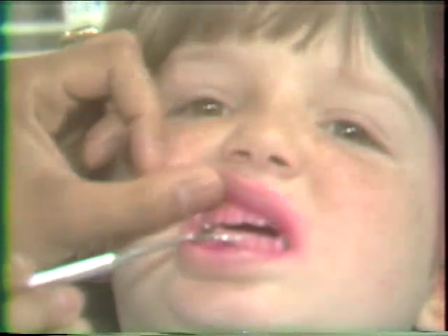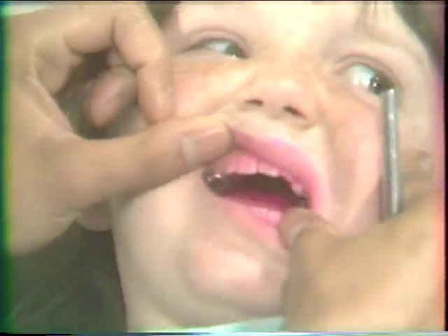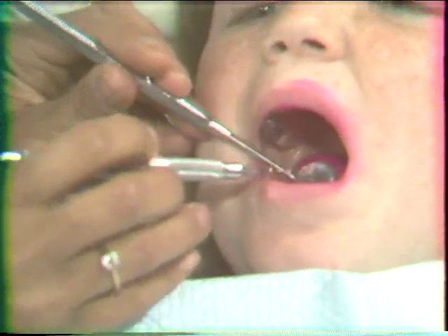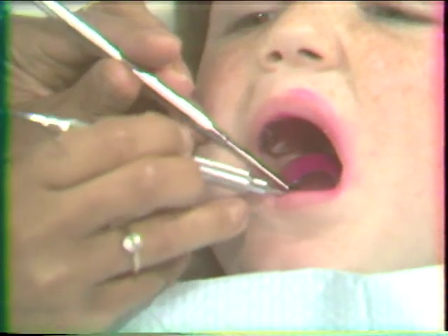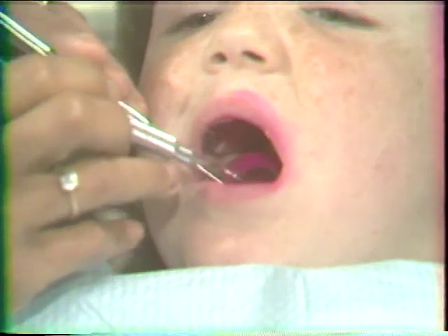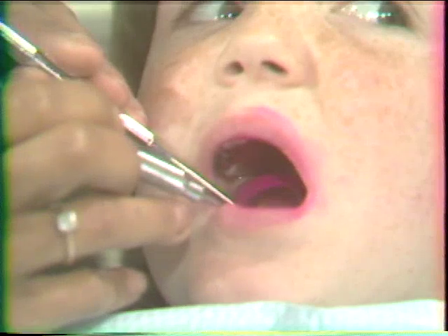Where gross calculus deposits are seen after disclosing, the operator should proceed to remove the hard deposits with a universal superficial scaler. To avoid nicking the teeth and surrounding tissues, these instruments are activated at an angle of slightly less than 90 degrees with the tooth surface.